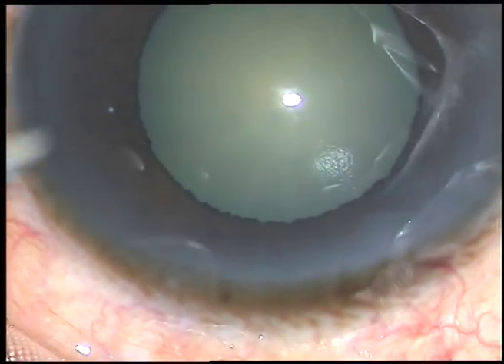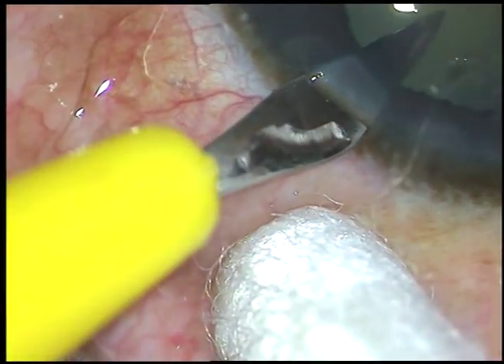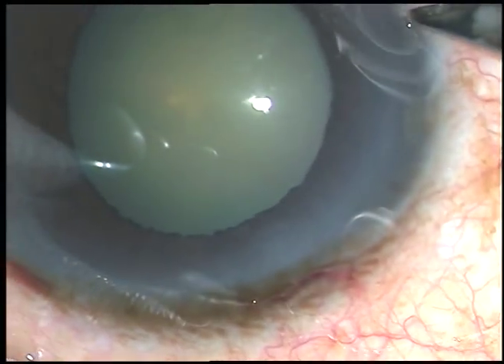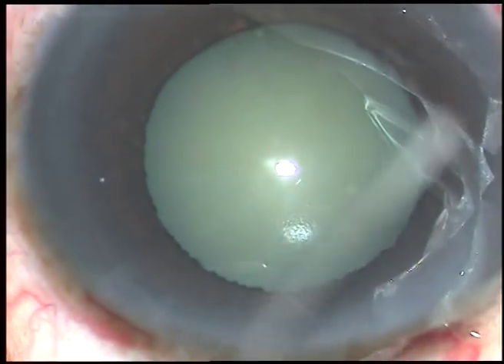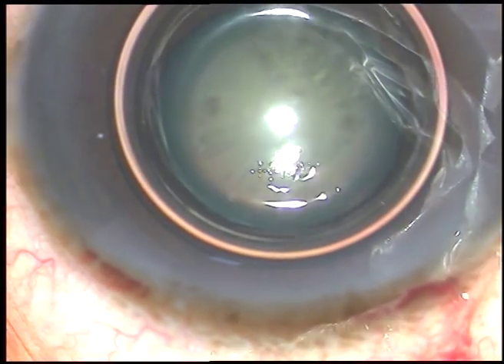The main incision has been placed. This is a 2.8 mm incision. This is a side port on the left side of the main incision, and one more side port is being made on the right side of the main incision. The side ports are about 3 clock hours away from the main incision.